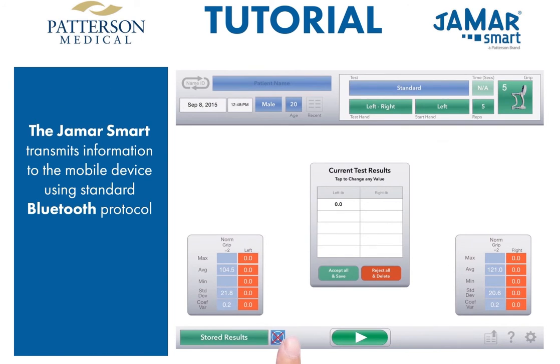First, let's make sure you are connected. If there is a red X through the Bluetooth connection icon, then we are not connected. Turn the JMR Smart on. The JMR Smart screen will display 'app,' and the red X will disappear from the Bluetooth connection icon.